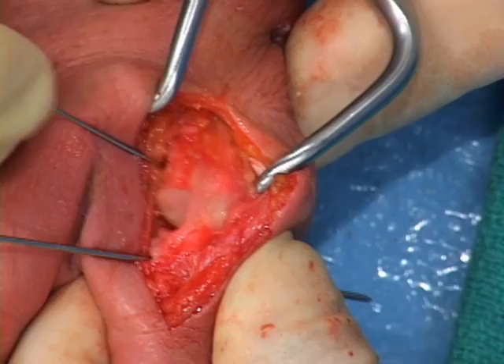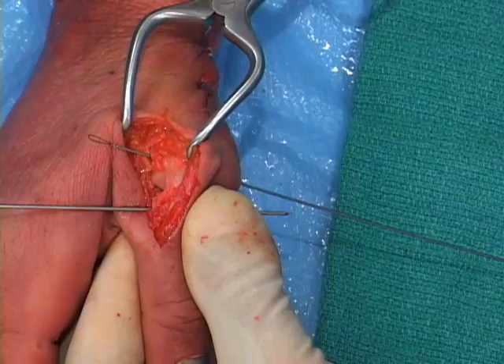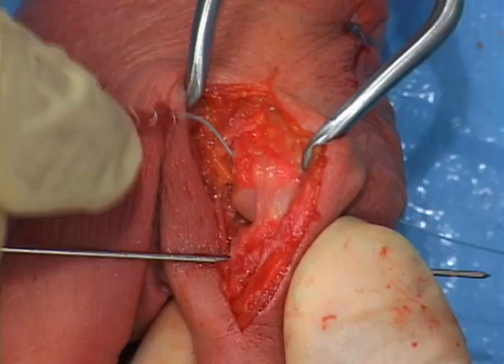The guide wire in the metacarpal is removed and replaced with the nitinol suture passing wire from the 3x8 mm biotenidesis instrumentation kit. The looped end of the passing wire is ulnar. The needles on the whip-stitched graft are cut off and the ends of the fiber loop are tied in a knot. The ends are passed through the looped end of the suture passing wire.